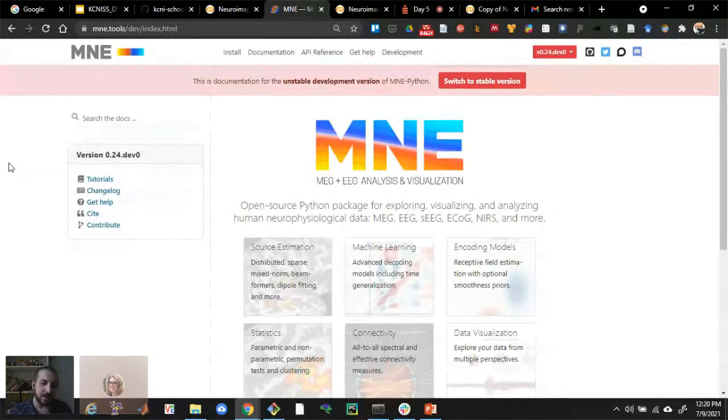To my estimation, according to the things that I find useful, but also in terms of the community component, which I think is an important part of open science and open source software, MNE is the best tool for doing EEG and MEG analysis. I can expand on the reasons, but I'll just leave it at that for now.